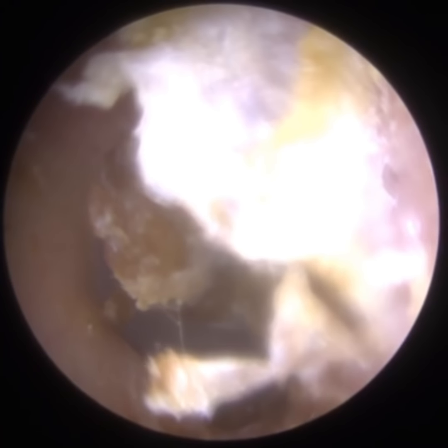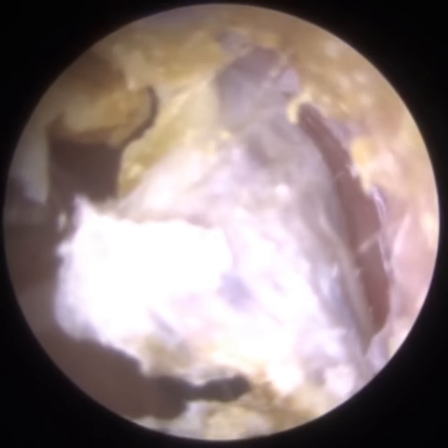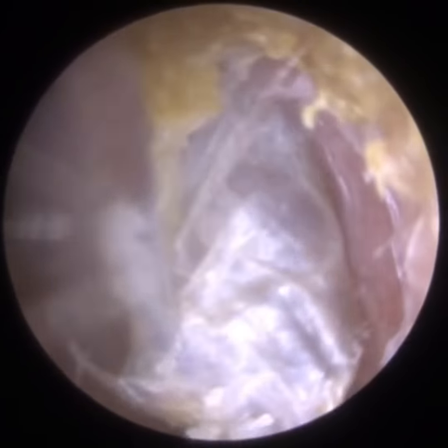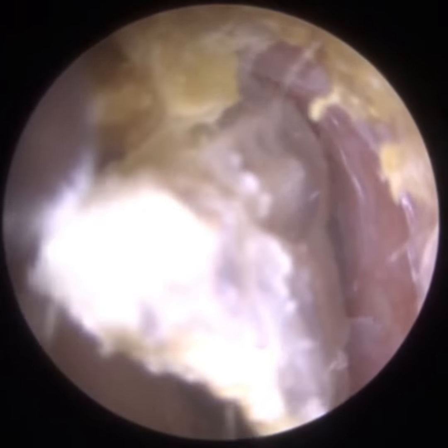I'm going to revert to, it's a bit of clarinetting. So clarinetting is when the skin violently flaps at the tip of the suction probe. So I've reverted to a fine end gauge. This is, I feel, a lot better at removing dead skin. You get far less clarinetting. Slowly but surely, you can see the fresh layer of healthy skin of the ear canal. All this is a dead coating. It was like a snake skin. It was really, really tough, this skin.